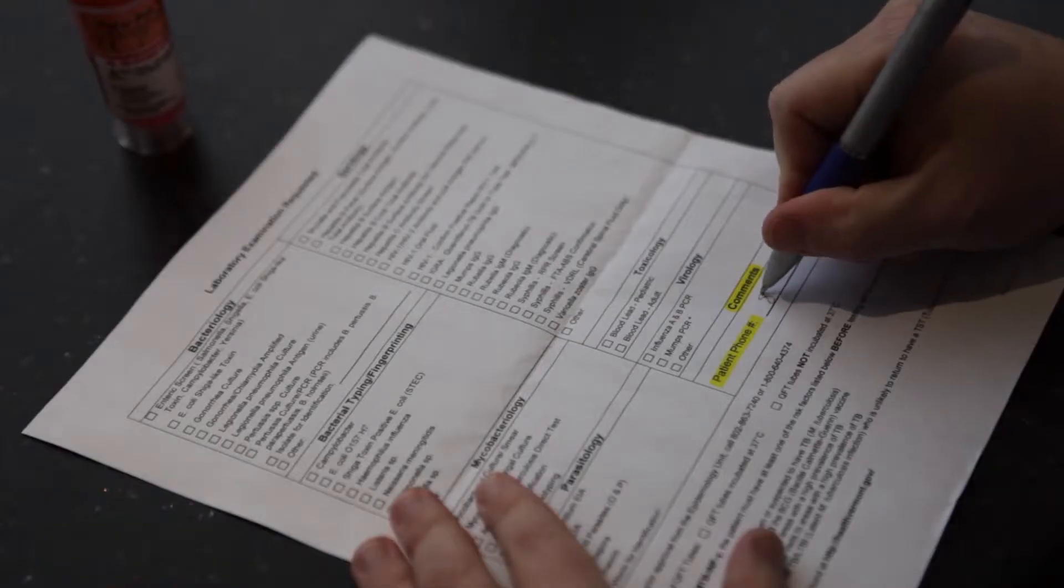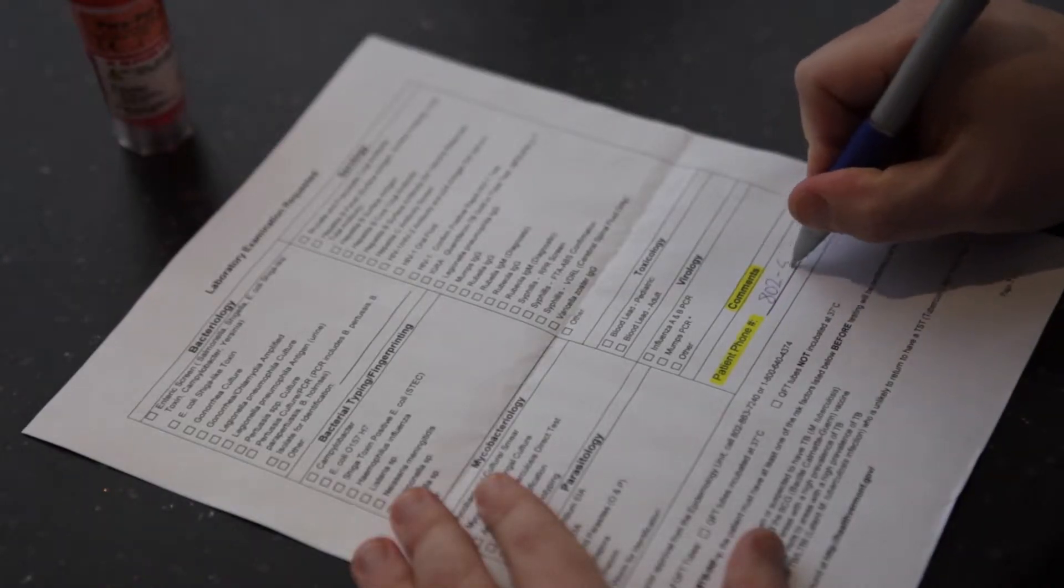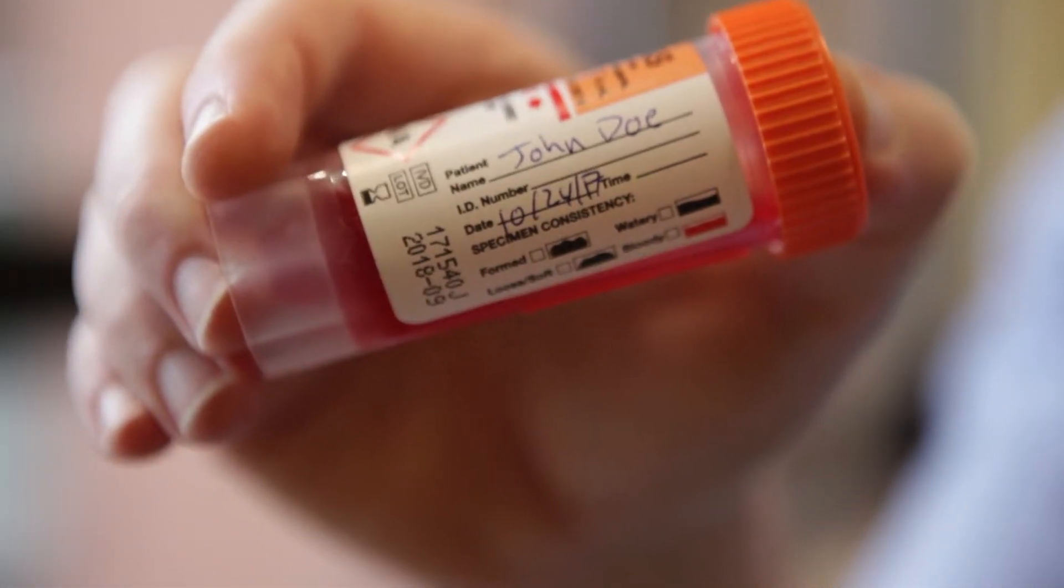First, complete the highlighted sections of the form. Be sure to write your phone number on the bottom of page two. Then print your name and the date you're collecting the sample on the outside of the vial.